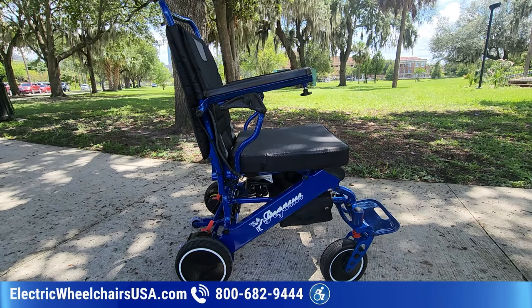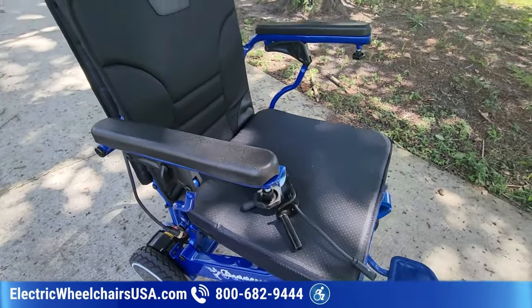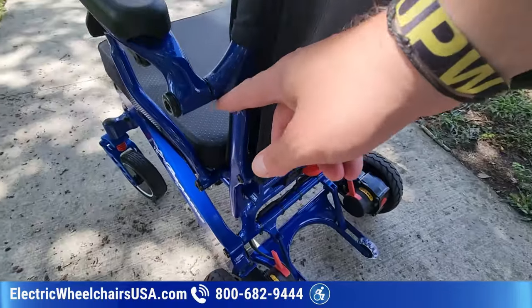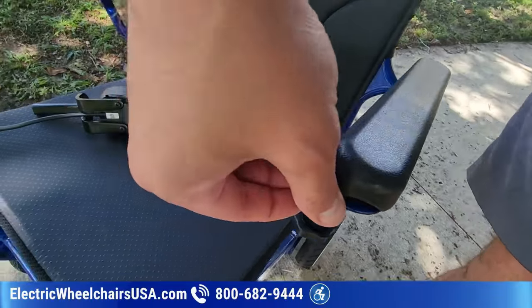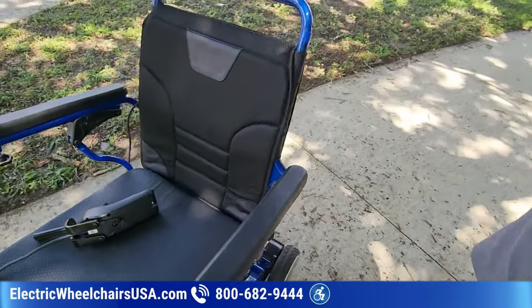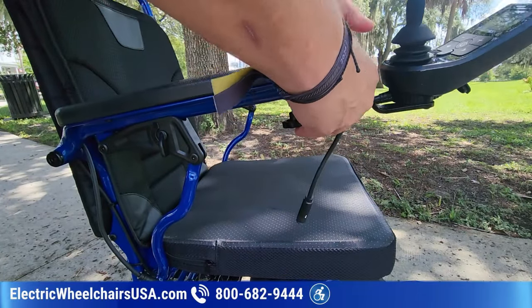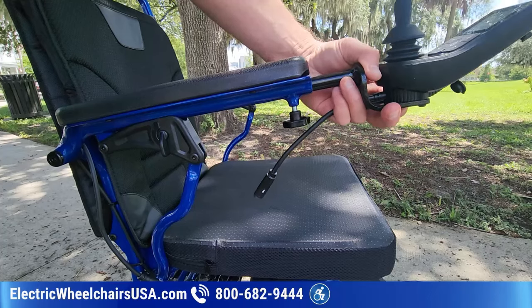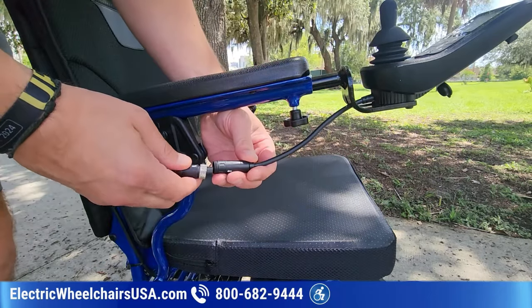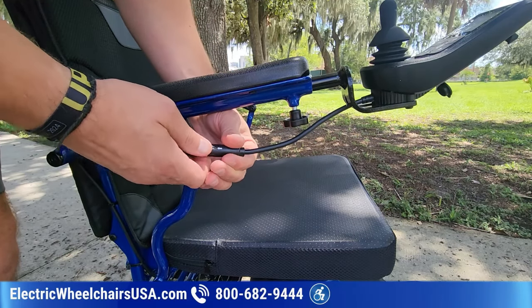Now, if you are left-handed, it's very easy to move this to the left side. So you just have to take the wiring and feed it through on this side, and you take this cap off, and then the screw is already here, so you can slide it into here. So really easy to do that. You can also adjust the length of the armrests a little bit. So if you were taller, you can bring it out or kind of bring it in. So you got a few inches here. You can adjust this. So I'll tighten this back onto the unit, and then I'll secure the joystick on. All right.